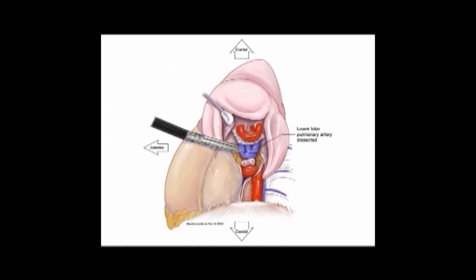Once the bronchial branches to the left lower lobe have been divided, all that is left is the pulmonary artery branches to the left lower lobe. Ensure that you are encircling, stapling, and dividing those branches going to the superior segment and the basilar segments of the left lower lobe, while preserving the lingular artery going to the lingula of the left upper lobe. Dissect the entry and exit points using blunt dissection to confirm you are completely around the pulmonary artery, then use a leader device or simply pass the stapler and divide. All that remains is the fissure, which can be stapled by passing a large purple or green load endoscopic stapler from the utility port, using lung clamps to retract the lung and expose the fissure for anterior to posterior division. A clamp is placed on the bronchus as the fissure is stapled.